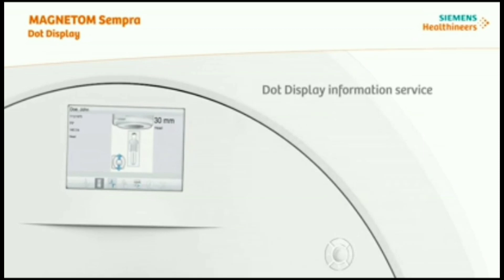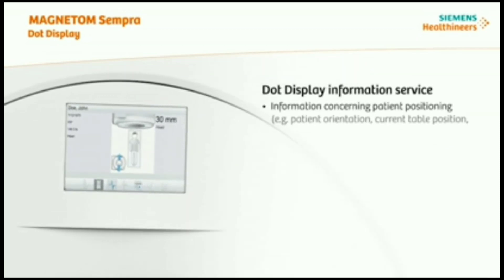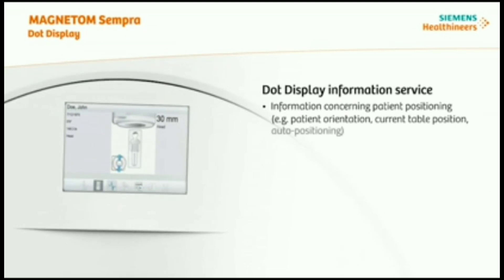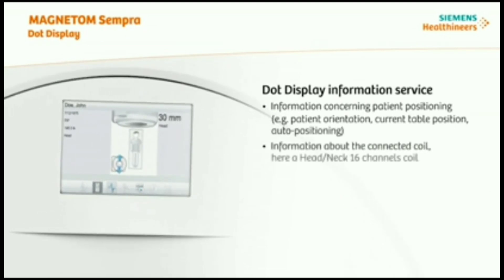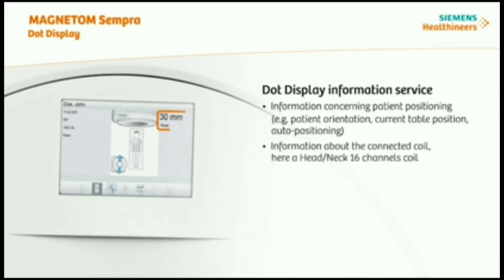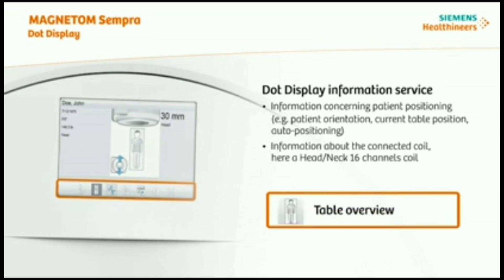The DOT display shows several pieces of information concerning patient positioning, like patient orientation, current table position, and auto positioning. It also shows information about the connected coil — here, a head-neck 16-channel coil. You can navigate between the depicted icons, and the selected icon is always highlighted on the DOT display.